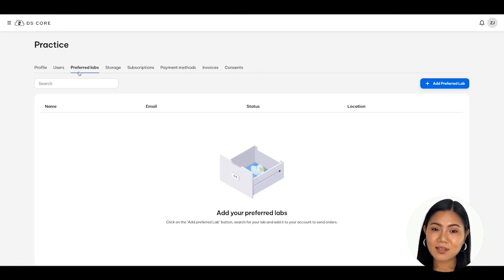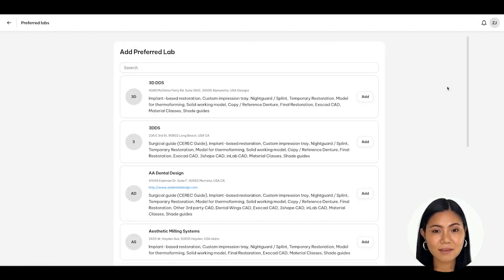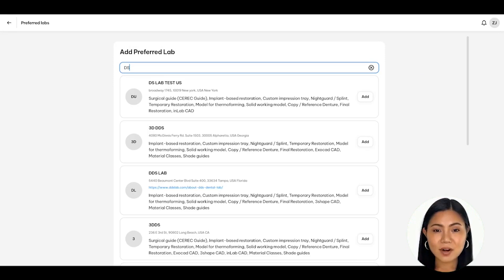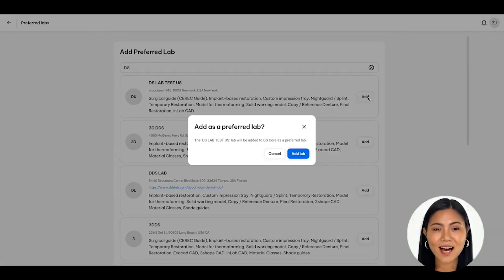In this section, you will see a blank list of where your preferred lab or labs would be listed. To add a lab, click on the blue button that says Add Preferred Lab. You will now see a list of labs on DS Core. To search for your preferred lab, click on the search bar and type in the lab name. The list of labs will adjust to your search settings. Once you find your lab, click the Add Lab button.